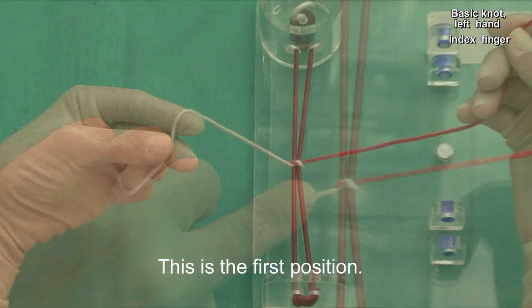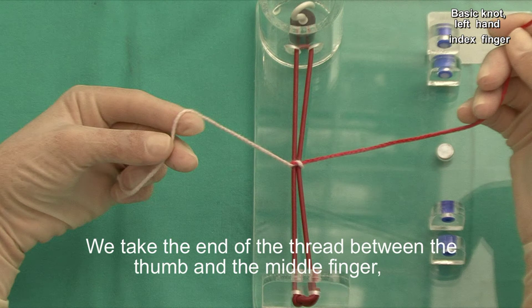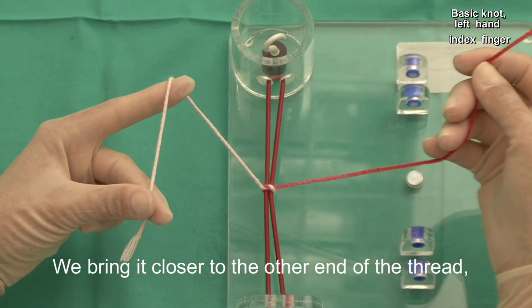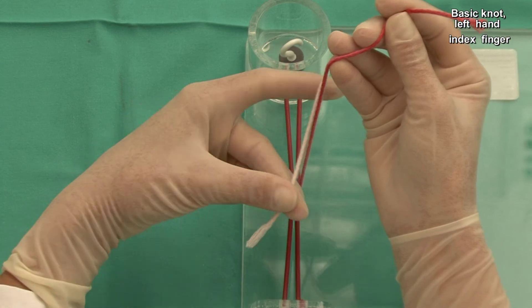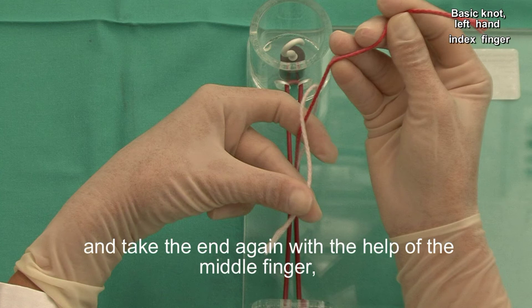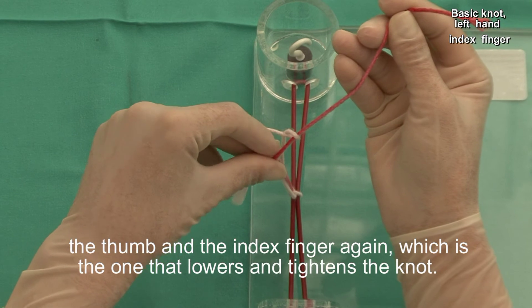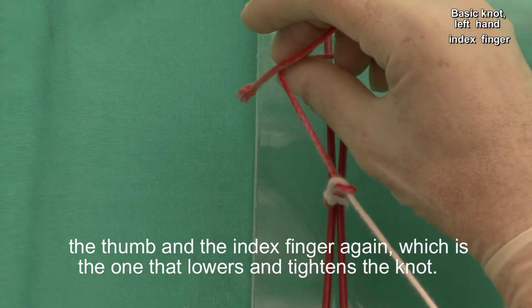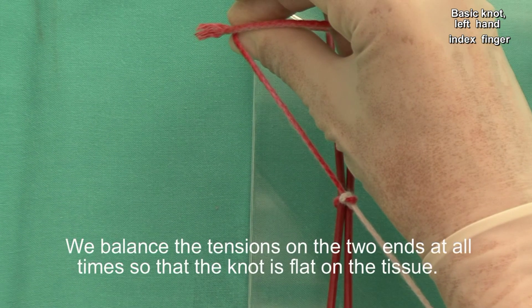This is the first position. We take the end of the thread between the thumb and the middle finger and we tighten with the index finger. We bring it closer to the other end of the thread, release the index finger, and take the end again with the help of the middle finger. The thumb and the index finger again, which is the one that lowers and tightens the knot. We balance the tension on the two ends at all times so that the knot is flat on the tissue.